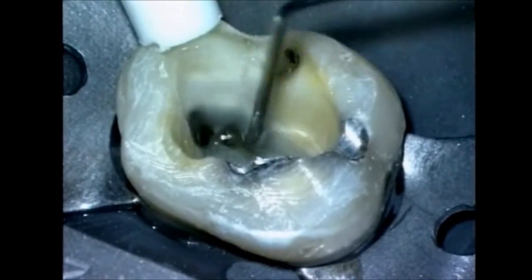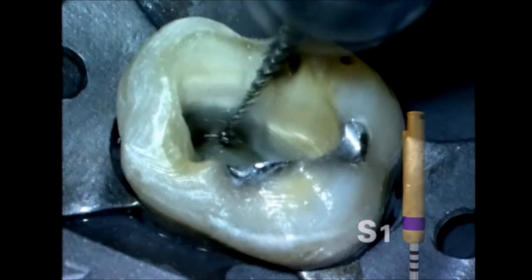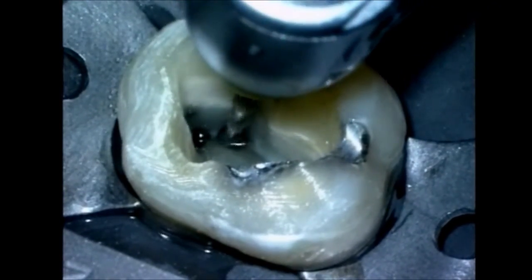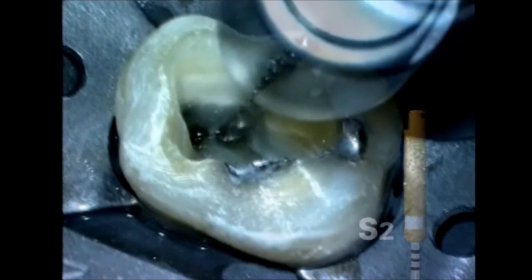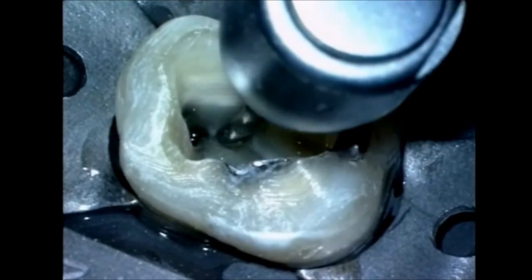With a smooth reproducible glide path, we can now use Shaper 1 to length. Shaper 1 is carried into the canal and will work primarily at the junction of the middle and the apical 1/3. Shaper 2 now can be carried to working length, and it's again allowed to move into the canal, and the shape can usually be cut in one single pass.